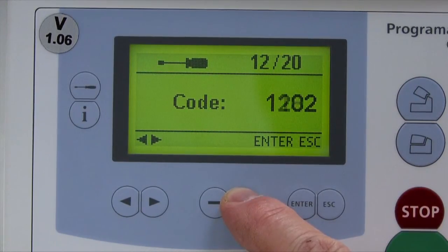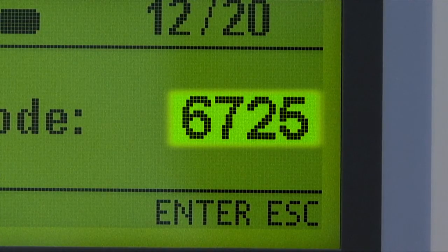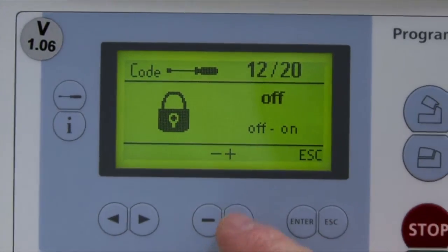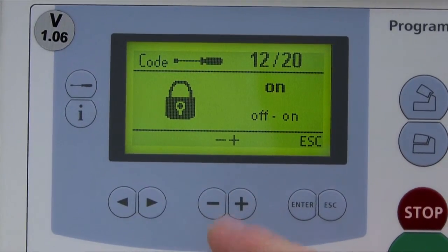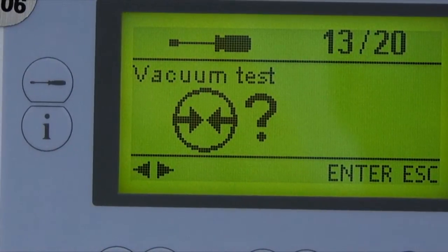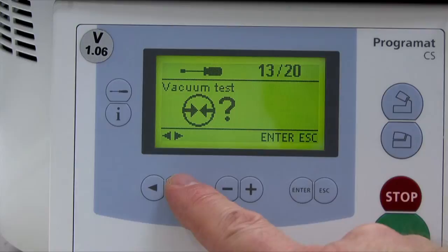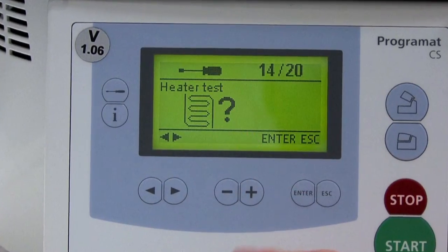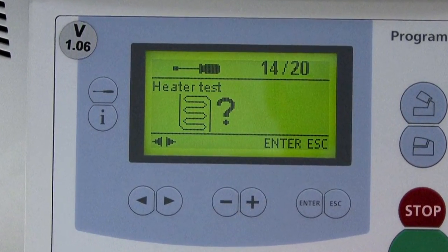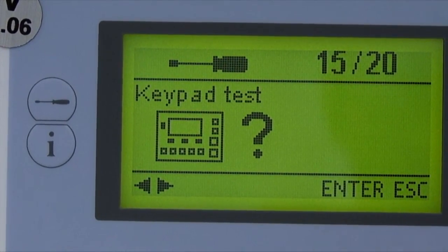The general write protection allows the user to lock all programs. To activate or deactivate, select Enter, then input the user code 6725, then select the plus or minus key once. If a program is locked, there will be a closed lock icon on the screen. The vacuum test program allows you to check the vacuum quality of the system. The heating muffle test program allows the user to check the heating muffle. The key test function allows the user to check the keypad; once selected, touch any key and an audible tone is heard when functioning properly.